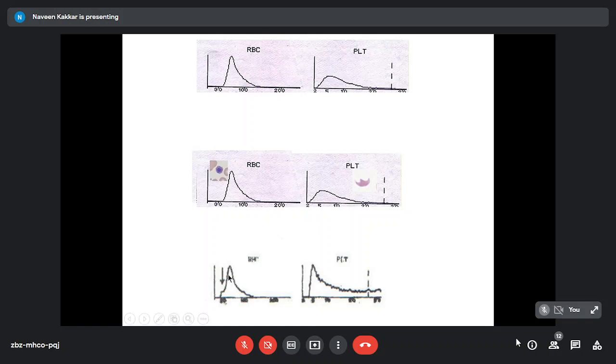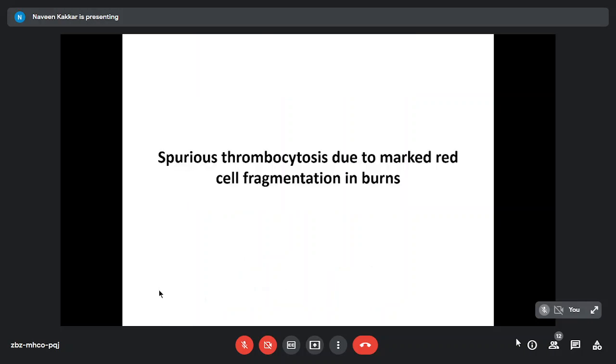And that's the histogram in this patient. That's the platelet histogram, that's the RBC histogram. If you see, the shoulder here is actually going into the platelet zone, which is here. So what you're seeing in this part as a red cell shoulder is actually the bulge beyond the platelet zone. So these fragments were falling into the platelet zone and being counted as extra platelets. So what was this? A spurious thrombocytosis due to marked red cell fragmentation in burns.